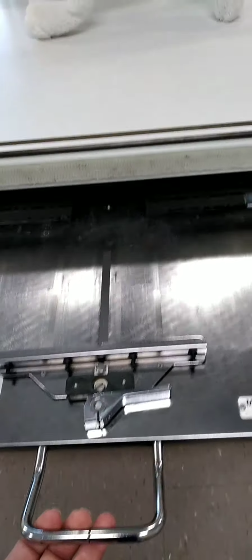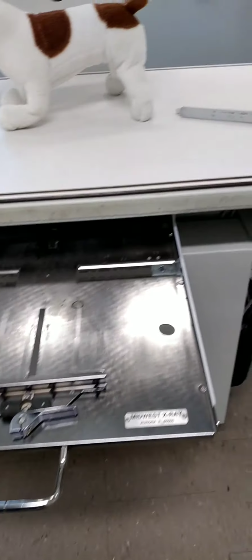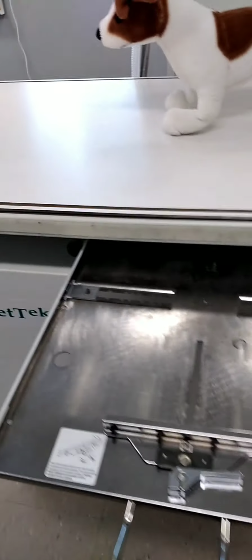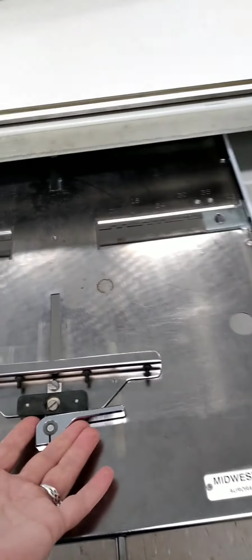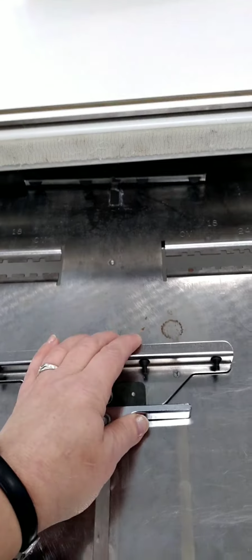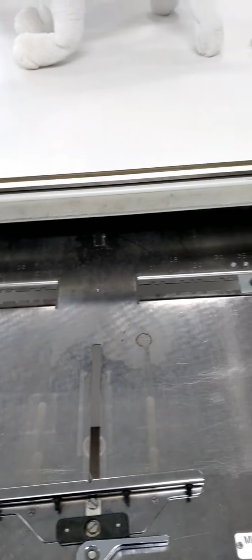Underneath the table is a tray that you can pull out. This is where you would place a cassette. All cassettes go in here. The digital cassette would go in here. Other cassettes can go in here and they get centered by a dual bracket pushing system. So if I push this forward, you can see that the further bracket came proportionally as I'm pushing or pulling away from it. I'll show you how this works when we do this in person. So this is the tray.